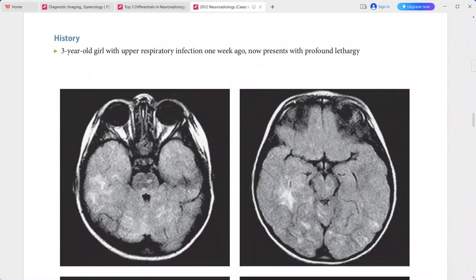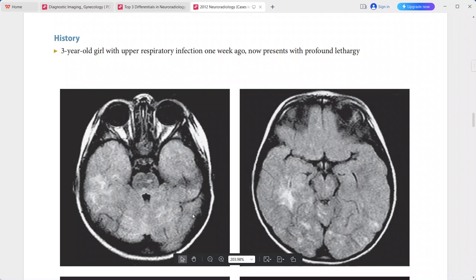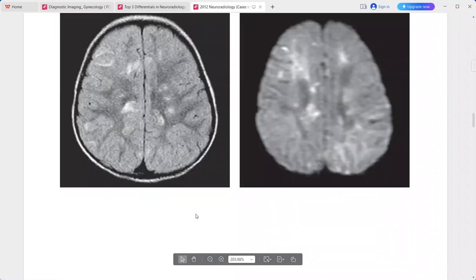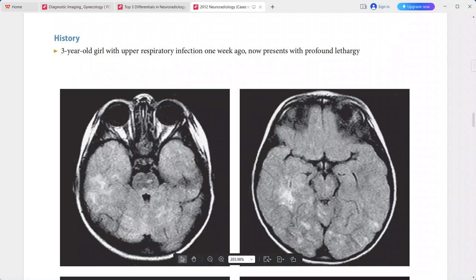Next is a 3-year-old girl with a history of upper respiratory infection one week ago, now presenting with profound lethargy. On FLAIR sequence, there are numerous asymmetric hyperintense lesions in the white matter of the cerebral hemispheres.